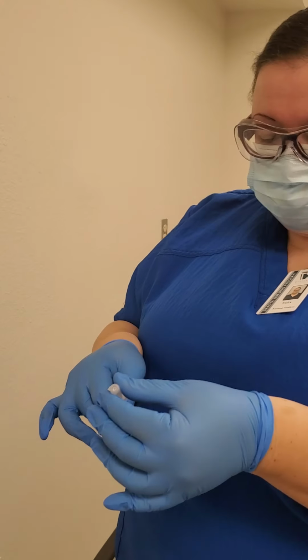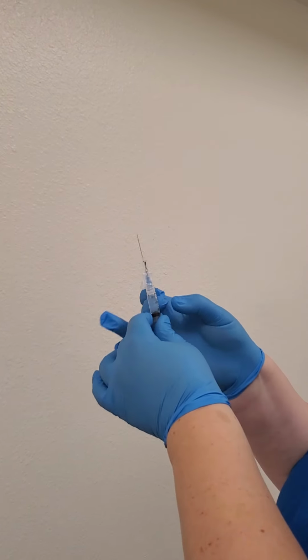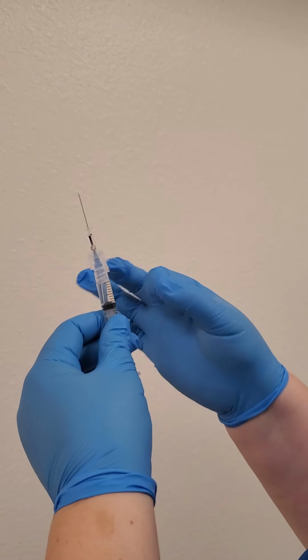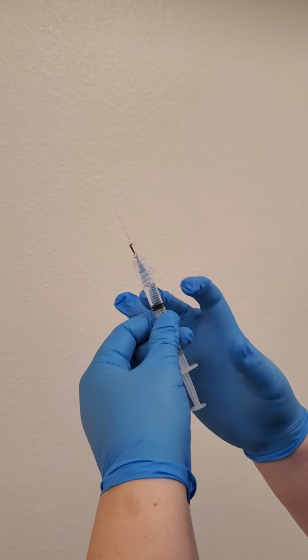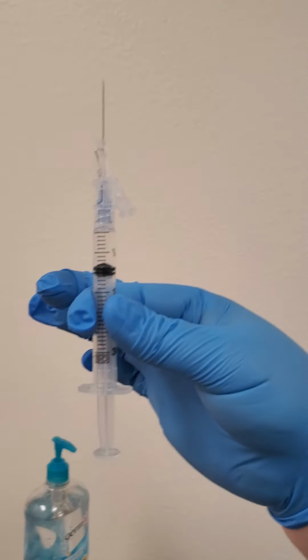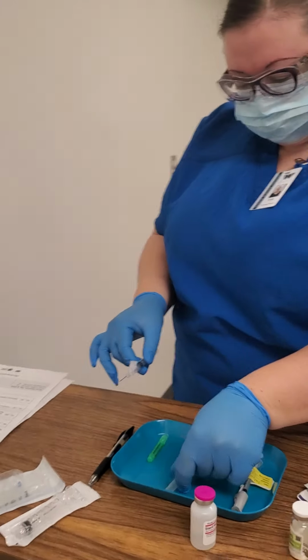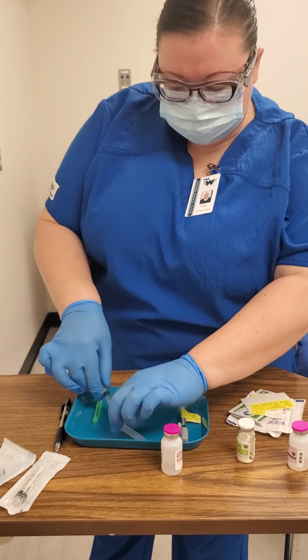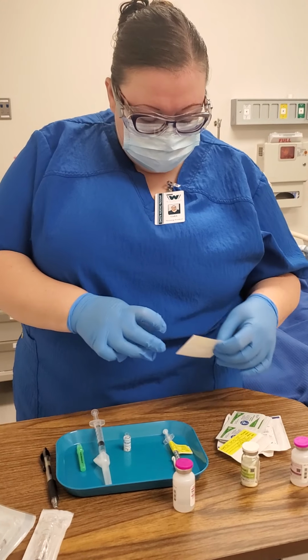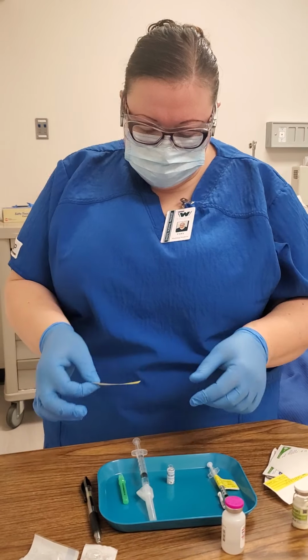I'm just going to take my cap off here, get my air out. Okay. And then I have my 1 milliliter there. Okay, I'm going to recap that. And I did the dimensional analysis on that. I don't know if I mentioned that earlier for the Finnegan. And it was 1 milliliter.